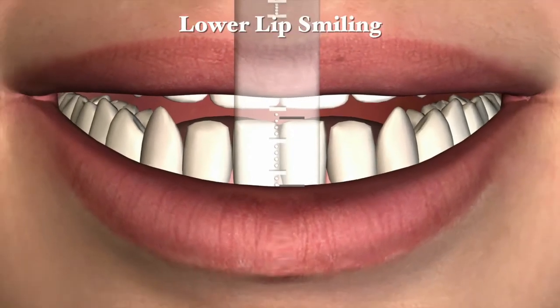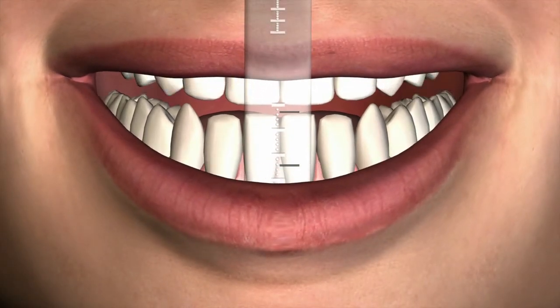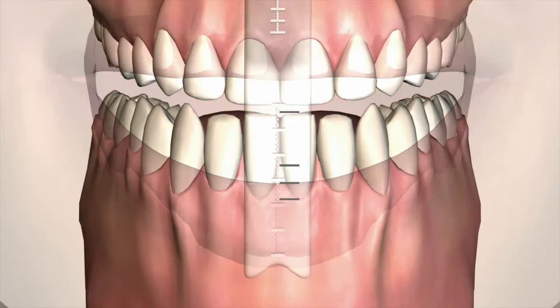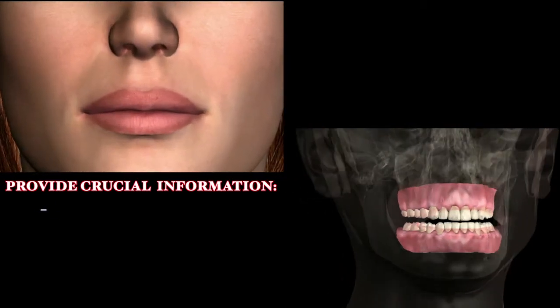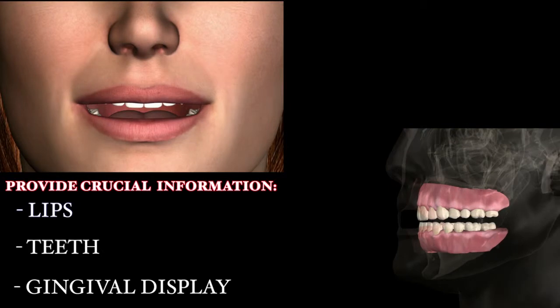Lower lip smiling: with the patient smiling, the lower lip's vertical position is marked on the ruler with a fine marker, as well as the position of the incisal edges of the mandibular anterior teeth. The gingival line is marked in gummy display situations. These measurements provide the dentist with crucial information relating the patient's lips, teeth, and gingival display to the overall facial mask.